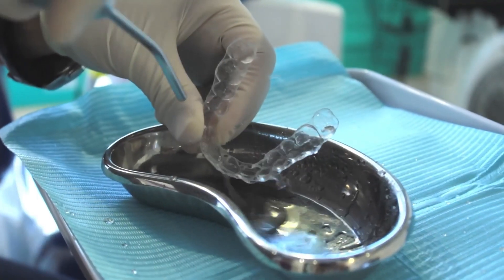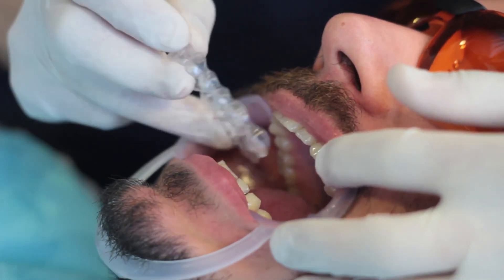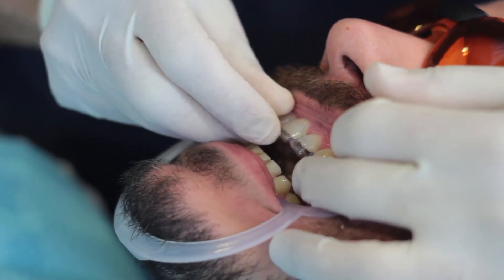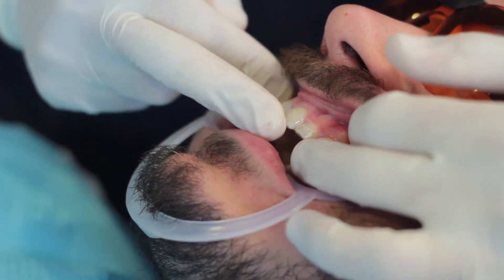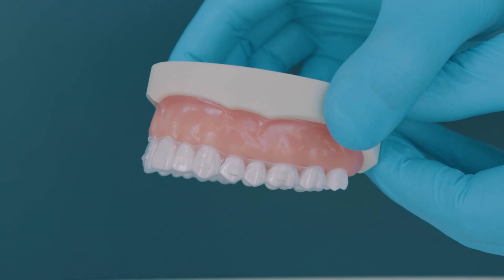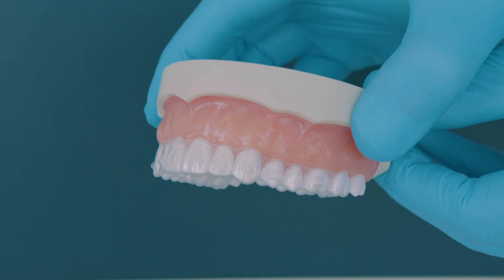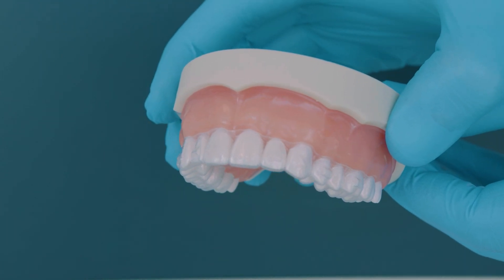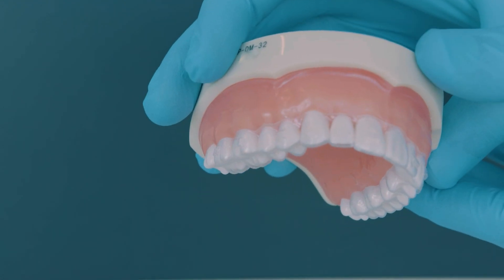First, rinse the attachment template with cold water and let it dry. Then, test fit the template on the patient's teeth, ensuring that it covers all the teeth and fits snugly until the last tooth in the arch. Notice how the template fits tightly, with no gaps between the incisal edges of the teeth and the template. In this case, we can proceed with the attachment bonding procedure.